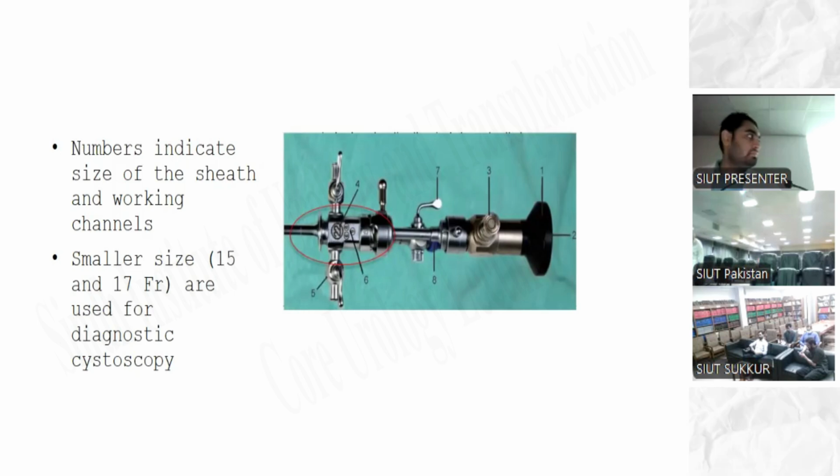Dr. Bakhtavar, you see the numbers written on this cystoscope sheet, right? Can you describe what these are and what they denote? Anyone from the class can describe what is written here, what the 22 indicates and what these numbers indicate? Dr. Bakhtavar: 22 indicates the working sheath size, 22 French. Right. And others? The largest number, right below the inlet and above the outlet channel, describes the sheath size that you have said, 17, 22.